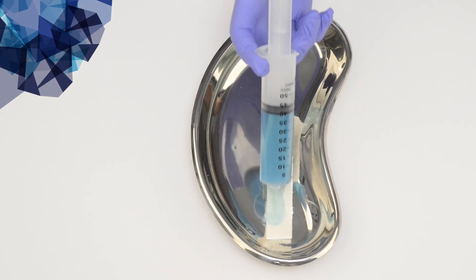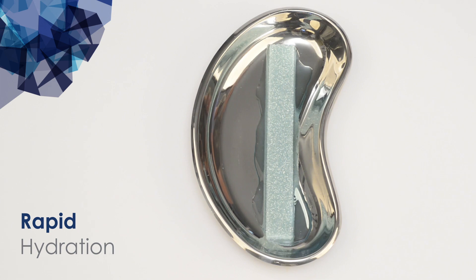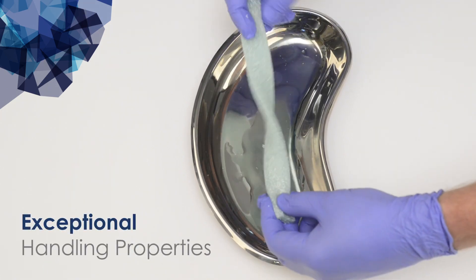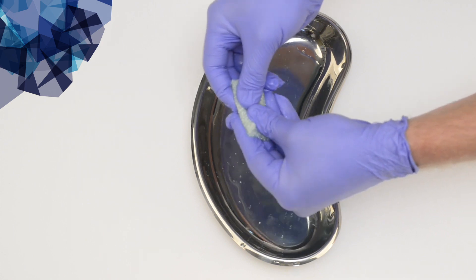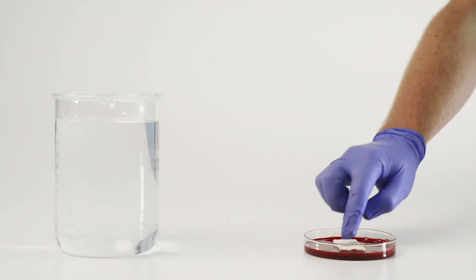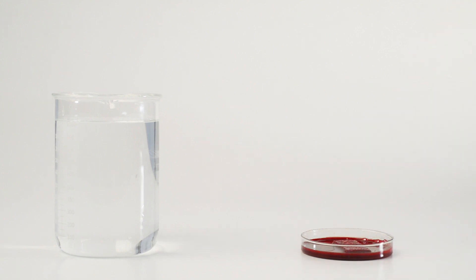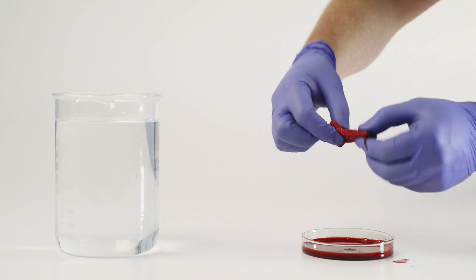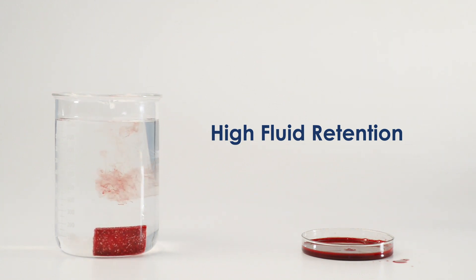The bovine type one collagen carrier provides rapid hydration and exceptional handling properties. The strip hydrates quickly in blood and demonstrates high fluid retention.